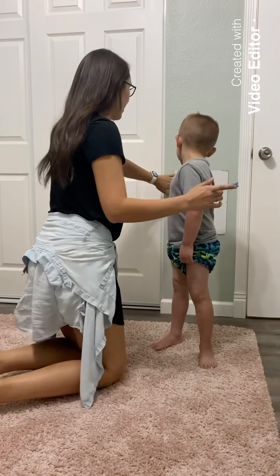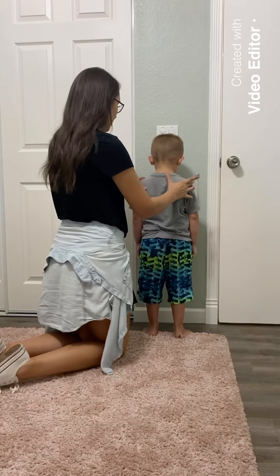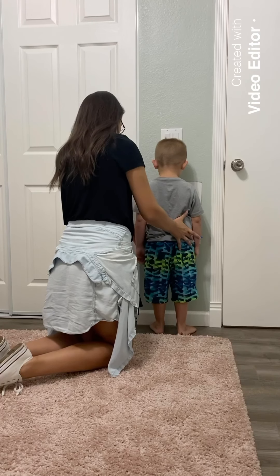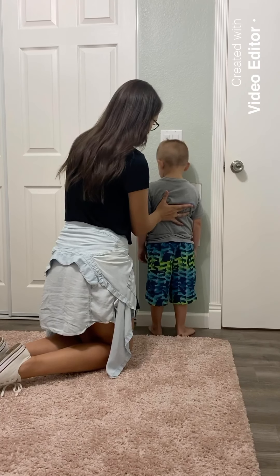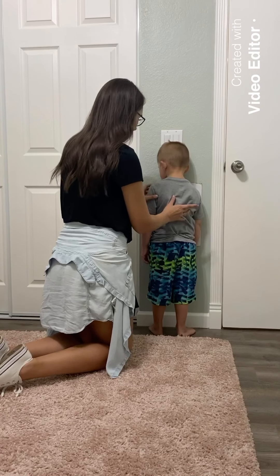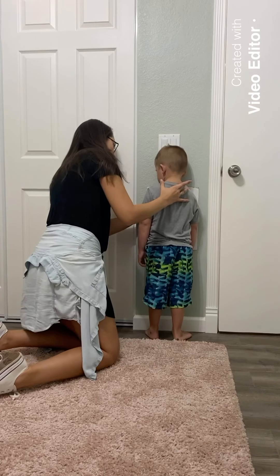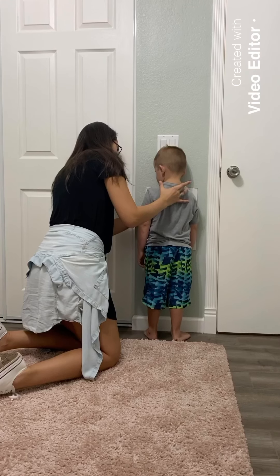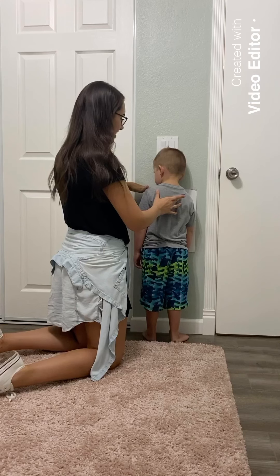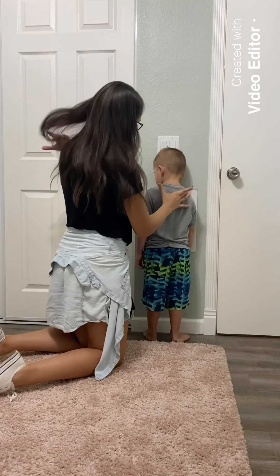Turn around and face this. Put your face towards it, okay? I'm going to take some pictures of your chest. Step all the way to it. And then turn your body this way — like that much. And push your chest against it. Is that okay? Okay. I'm going to feel you right here. You've got this little bump on you. So my IR is going to be an inch and a half above his jugular notch, and he's 15 to 20 degrees rotated here.